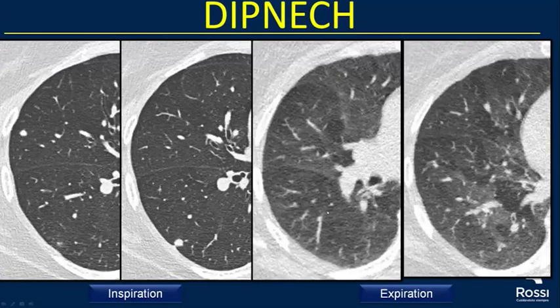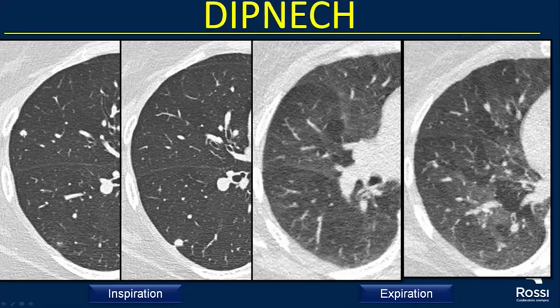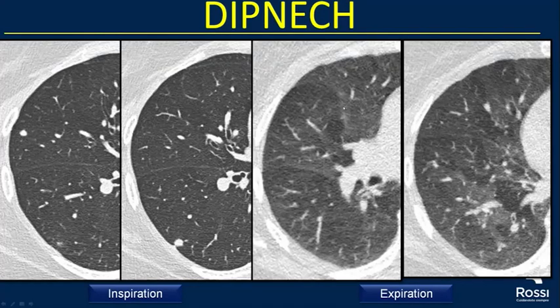DIPNECH is a rare and largely unknown disease due mainly to neuroendocrine cells, usually seen in women. When you see a woman with diffuse small nodules around the parenchyma, perform an expiratory CT. In this patient we have the nodules, and the expiratory CT shows areas of normal lung and areas of air trapping with diminished vascularity due to DIPNECH.